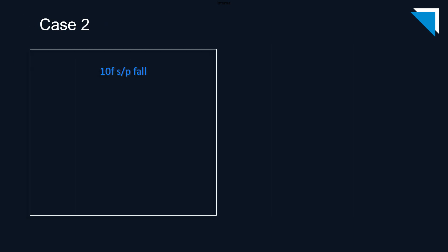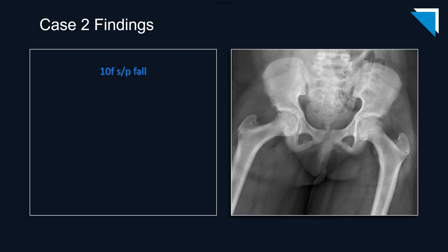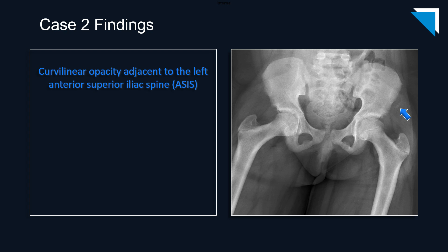Our next patient is a 10-year-old girl status post fall. Only one image for this case — this is an AP radiograph of the pelvis. There is a subtle curvilinear opacity abutting the left anterior superior iliac spine, which is consistent with an avulsion fracture.